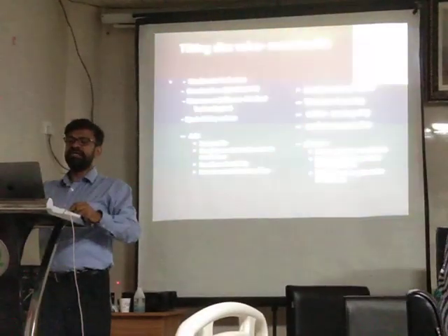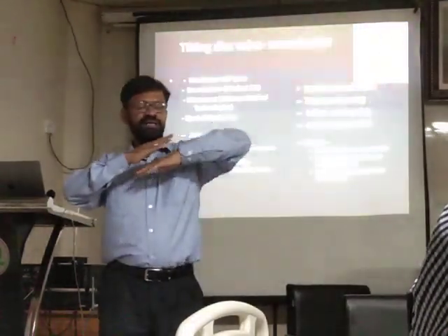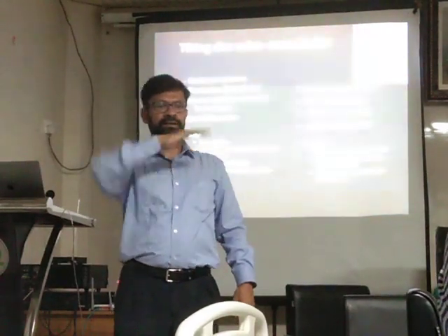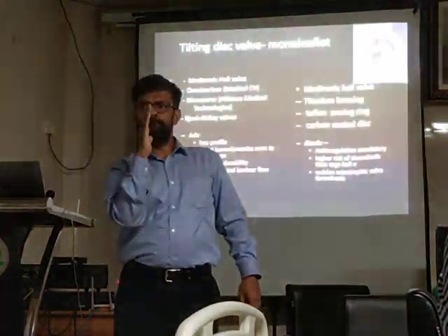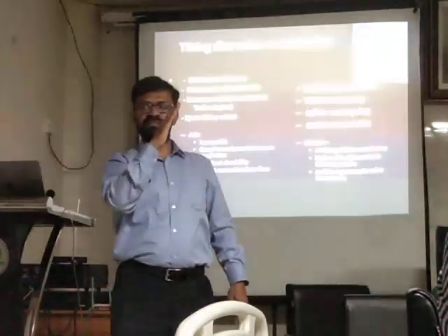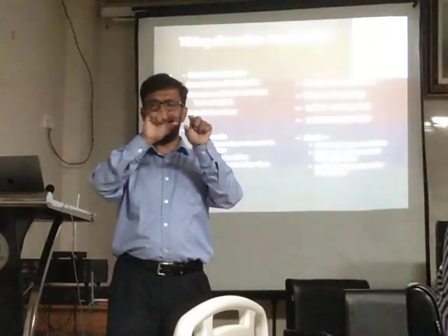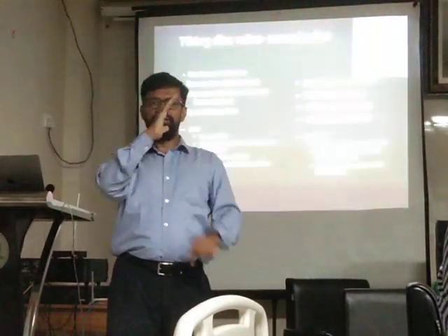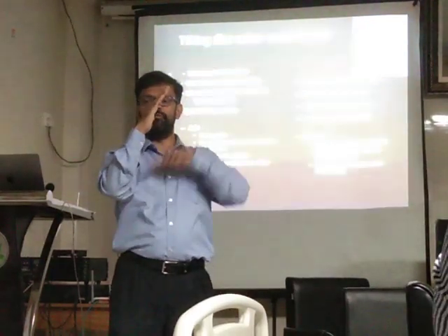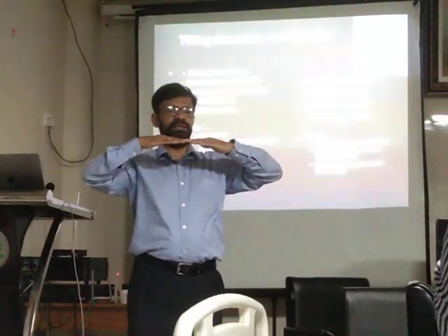The second is the tilting, single leaflet valve. So basically, the leaflet opens up like this. It doesn't open completely to 12 o'clock. It goes up to 75-80 degrees. And this fulcrum has a longer arm and a shorter arm. It becomes like this and this. So it will have one major jet and a second minor jet, while the bileaflet will be opening like this.